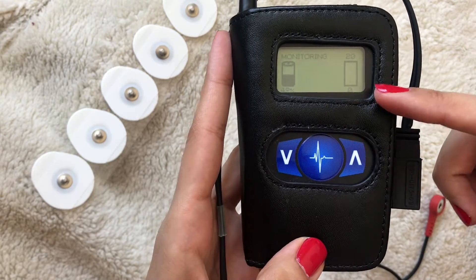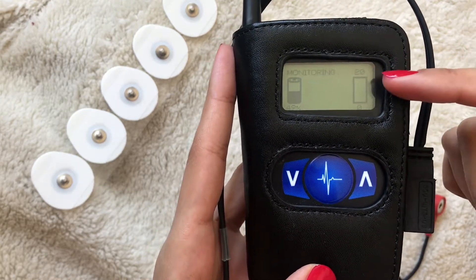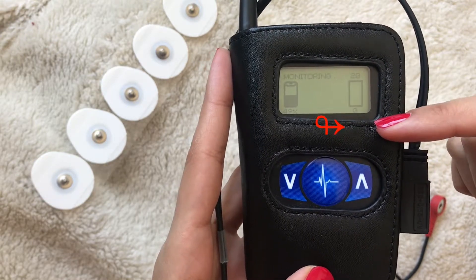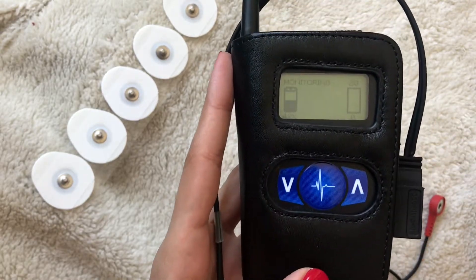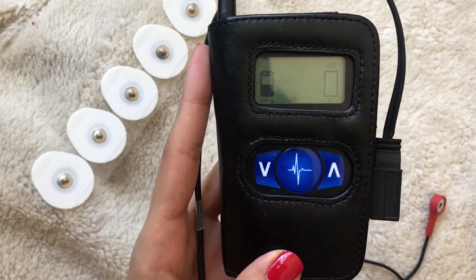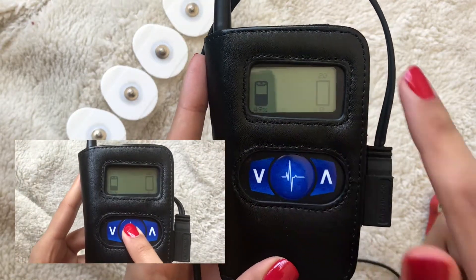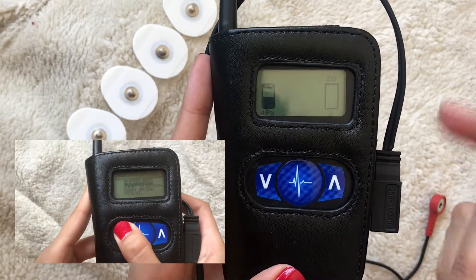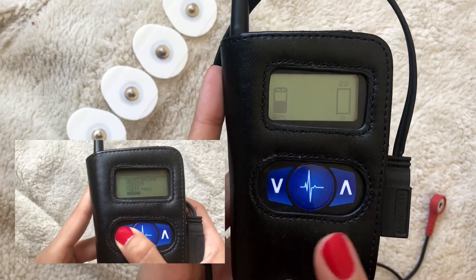The two numbers on the side: the first number — currently 20 — indicates how many events can be recorded and the storage space available; the zero indicates the number of events still needing to be transmitted. In case of an emergency, you press the central button, a menu pops up, and you use the arrows to select the symptom you're feeling. It will then start recording 30 to 60 seconds prior to you pressing the button.